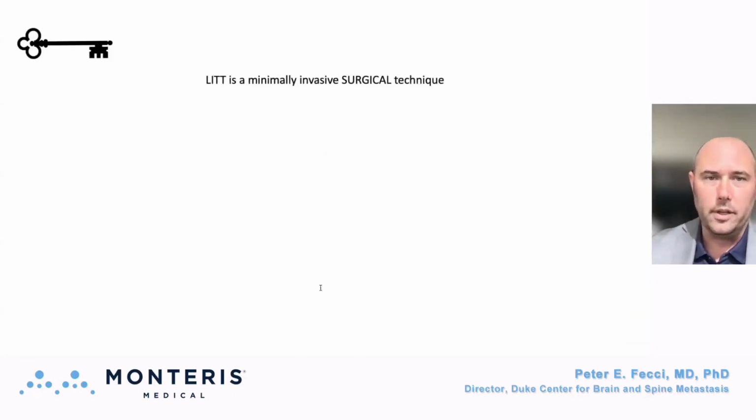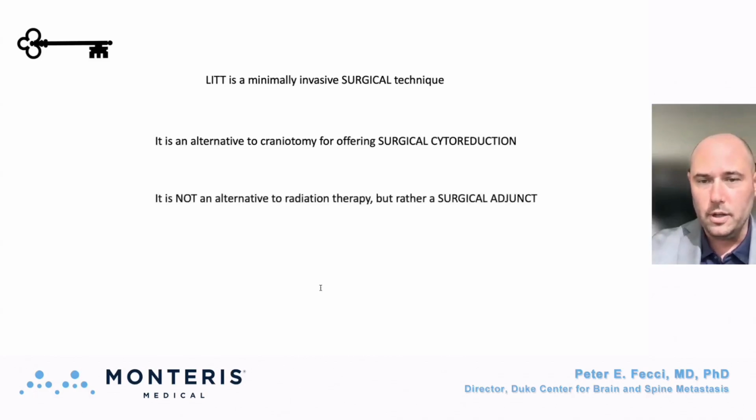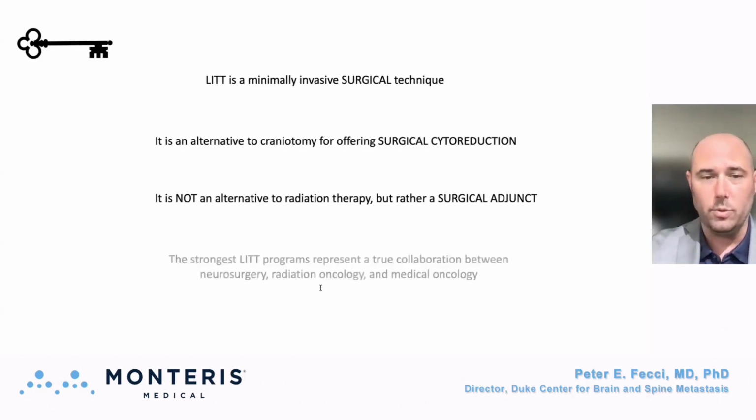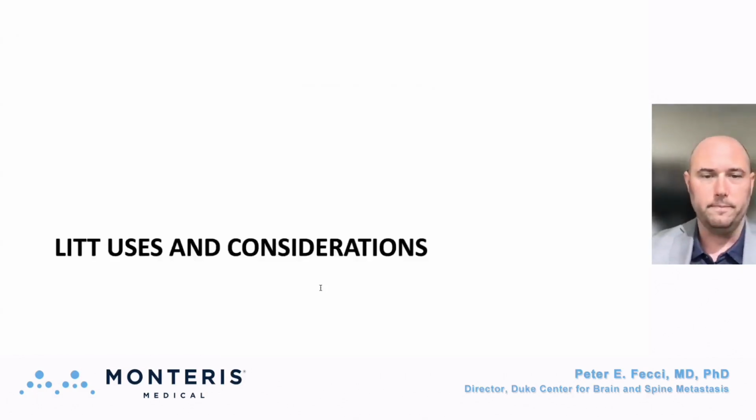Number 1, LITT is a minimally invasive surgical technique. Again, it is not an alternative to radiation. It is an alternative to craniotomy for offering surgical cytoreduction. It is a surgical adjunct to those other types of therapies like radiation, much like craniotomy would be. And the strongest LITT programs really do represent a true collaboration between neurosurgery, radiation oncology, and medical oncology.